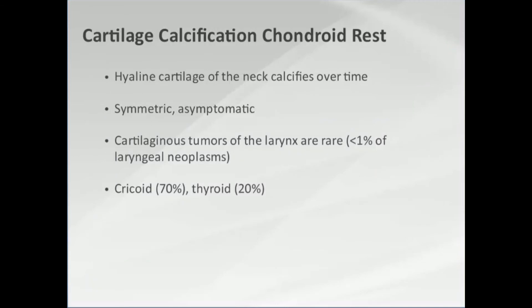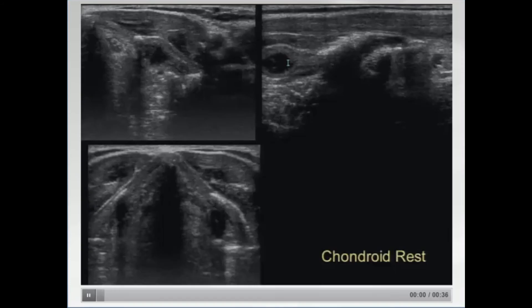One thing to be aware of when scanning a post-thyroidectomy neck is that less experienced imagers, with no thyroid gland to picture, start photographing a lot of things in the neck that belong there — like vocal cords or structures they hadn't noticed before. One important thing to know is that the cartilage of the neck calcifies. It starts out sonographically visible and then can calcify as patients get older. It should be symmetric and asymptomatic, because cartilaginous malignancies of the neck are extremely rare.